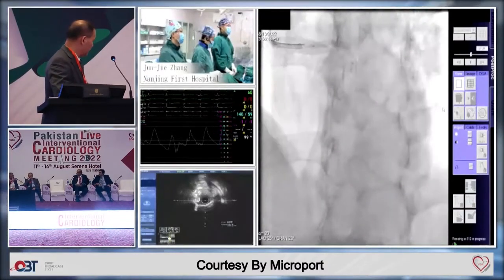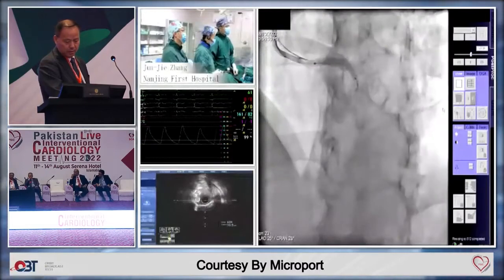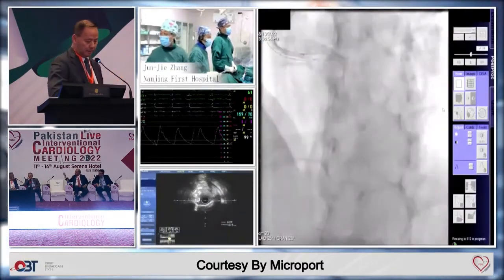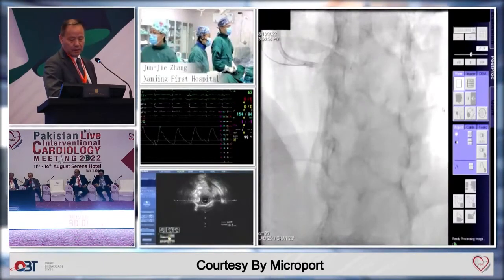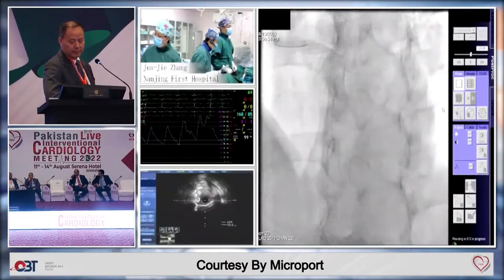The left main is always at an angle, so you'll have some protrusion. And he's put a marker wire there, if you notice, to see where the ostium is. You hang a wire over there, a marker wire. So how much is the inflation pressure?